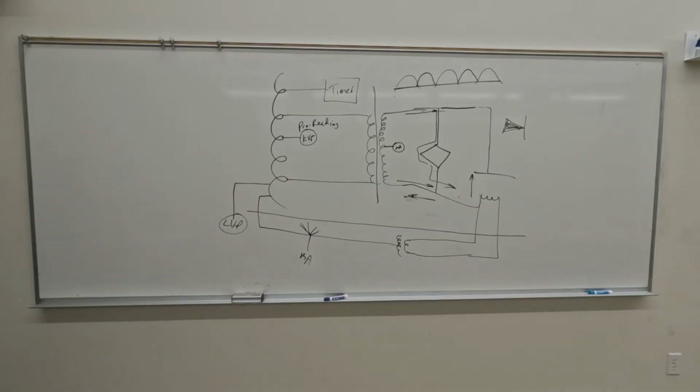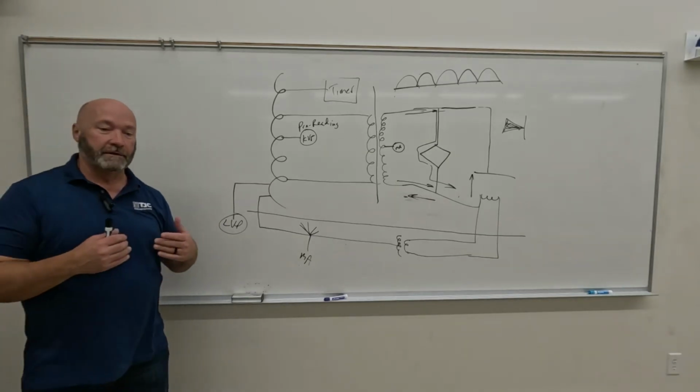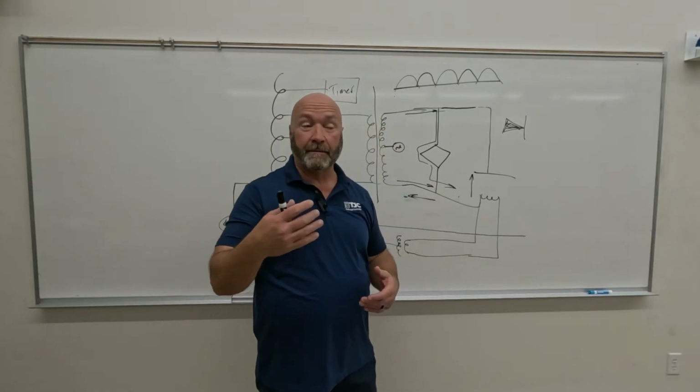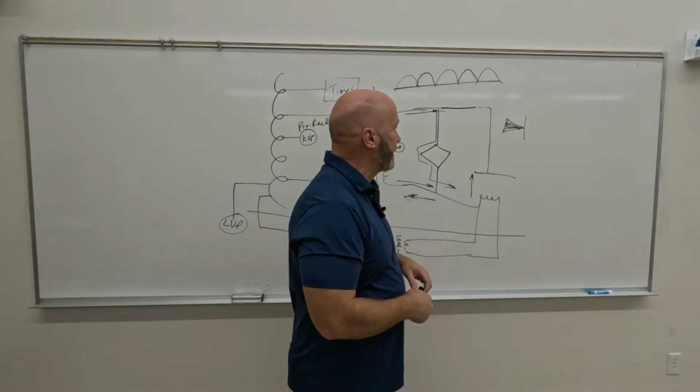If you look on page 105, you see them as well, on the diagram at the bottom of the page. You see it also on page 104. So every time you see that arrow hitting the dead end, that's a rectifier. On 102 it's just drawn all by itself. Those are silicon-based rectifiers. They're semiconductors. They allow electrons to go in one direction and prevent them from going in the opposite direction.